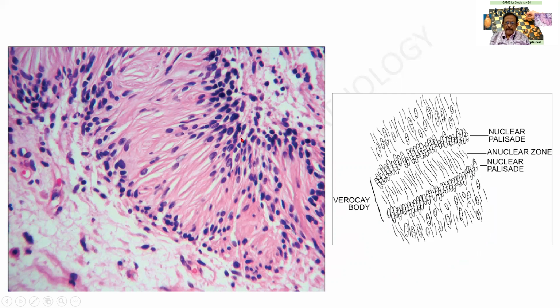Here, as we had explained earlier and as also shown in this diagram, I find that there is an attempted palisading, and these are the extensions of the cytoplasm that I am seeing. Whereas this area appears edematous, I am finding a few lymphocyte-like cells and occasional blood vessels. So this will be the Antoni B area and this is the Antoni A area.